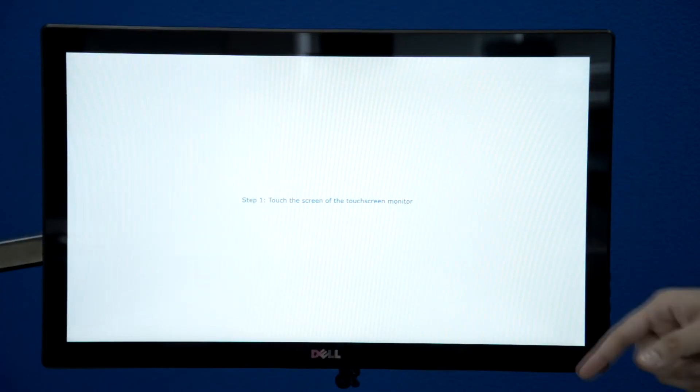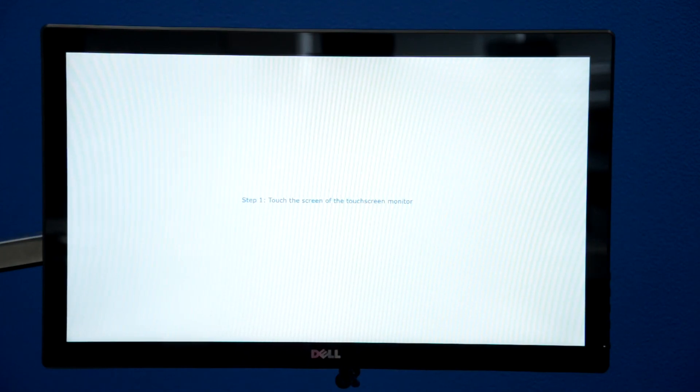A very important setting is monitor settings. Sometimes after transportation or after a Windows update, monitors might get mixed up because they have specific numbers.